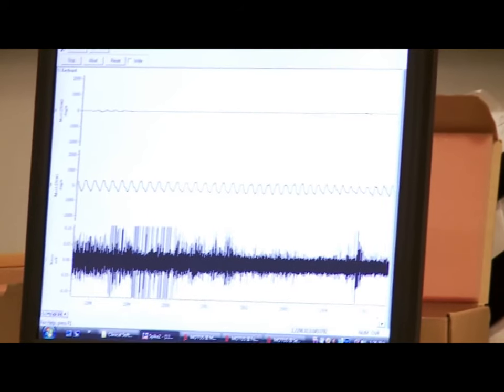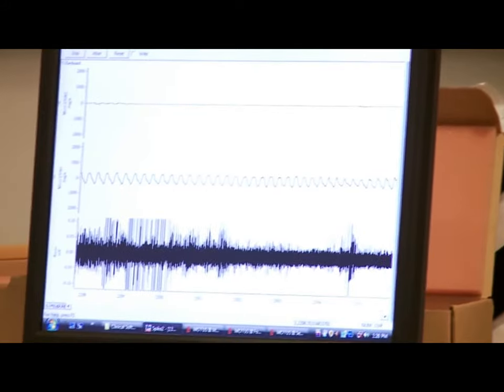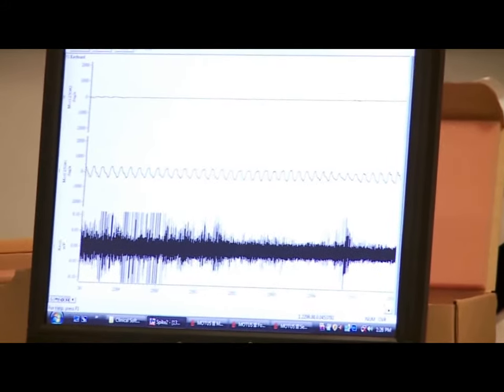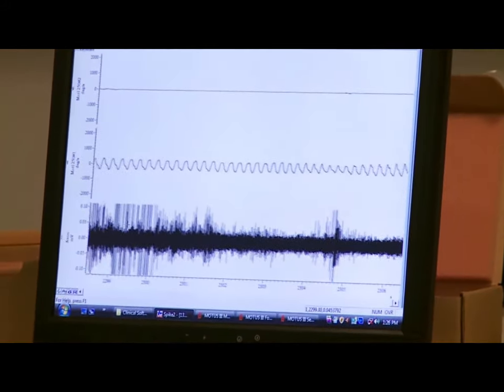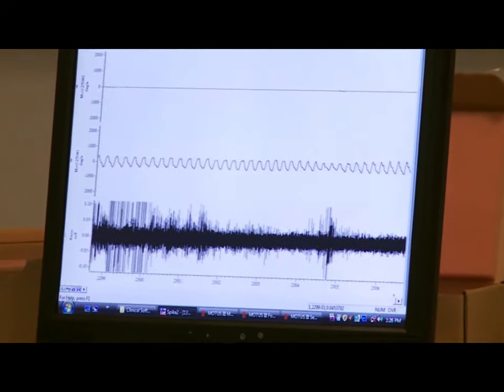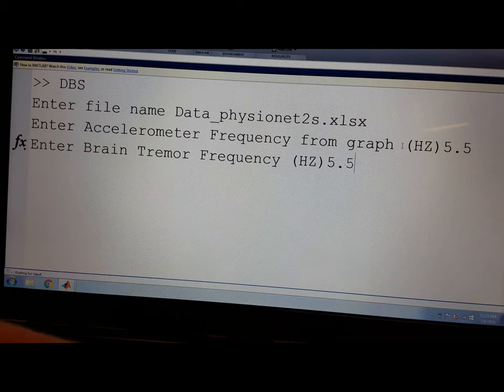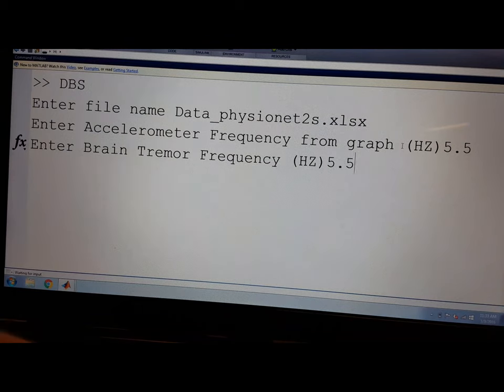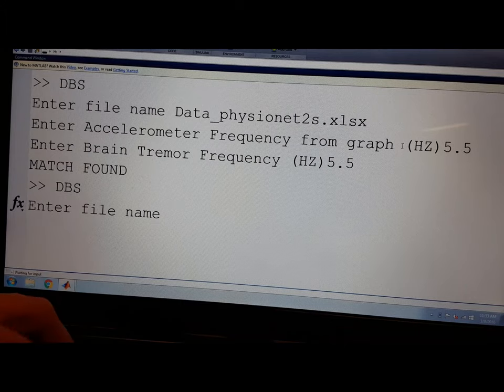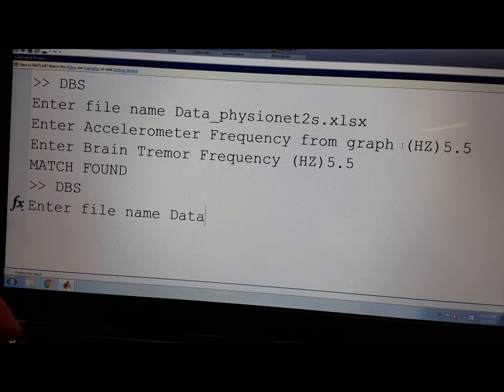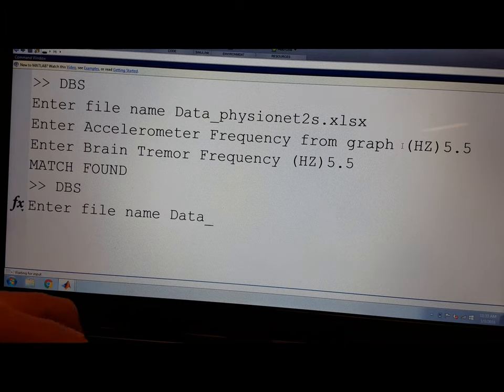The next step is to use the microelectrode to record frequency of the deep brain structures. Eureka will produce another frequency plot in which the surgeon will choose the correct frequency. Eureka will then take the two chosen frequencies and compare them.